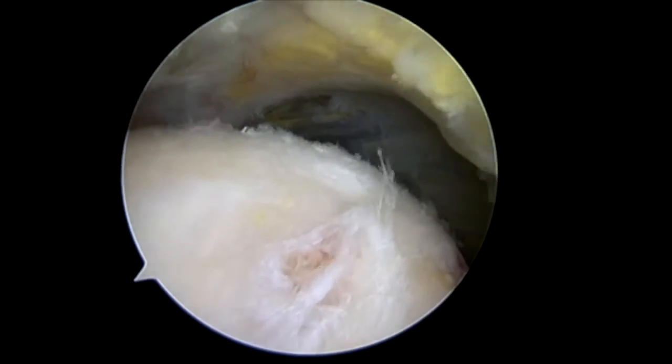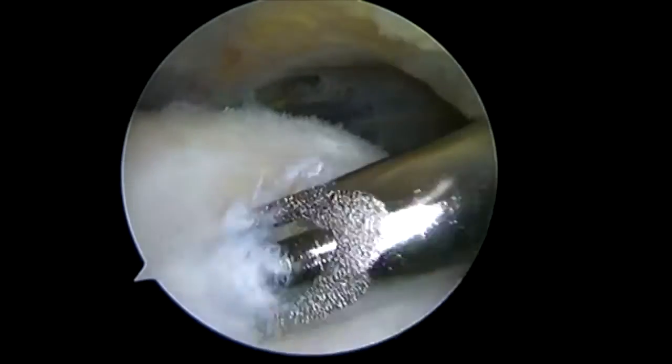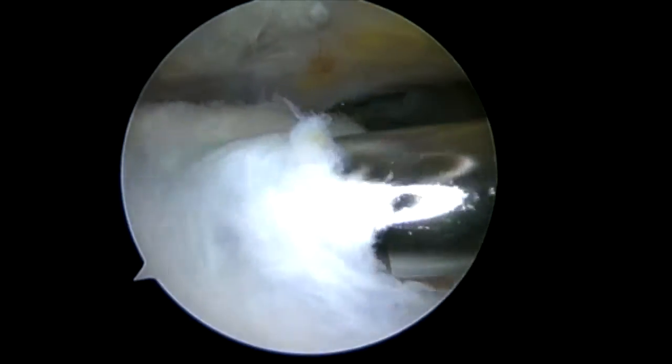Hi, I'm Dr. Chris Doherty. I'm a fellowship-trained sports medicine orthopedic surgeon with the Agility Center in Bentonville, Arkansas. Here I'm going to demonstrate the use of the rotation medical patch for the repair of a rotator cuff.